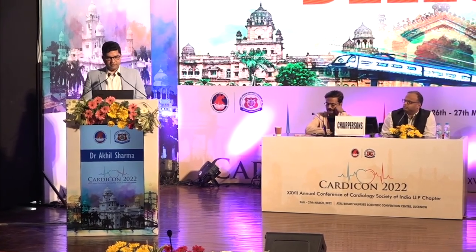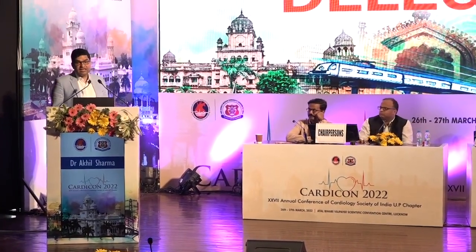That's the time that we have, Mr. Chairman. We'll have to move on to the next presentation. Actually, I would just like to comment on TE. We tried some patients with TE, but when we historically compare our data and results with TE-guided puncture, it's very difficult for our patients and very painful. Surprisingly, we didn't have any unfortunate event with our patients on fluoroscopy, and we are much more comfortable with fluoroscopy without TE. But definitely, it's another modality we should incorporate. We tried, but we couldn't convince ourselves and our mentors. Okay, thank you. That's followed by 2.